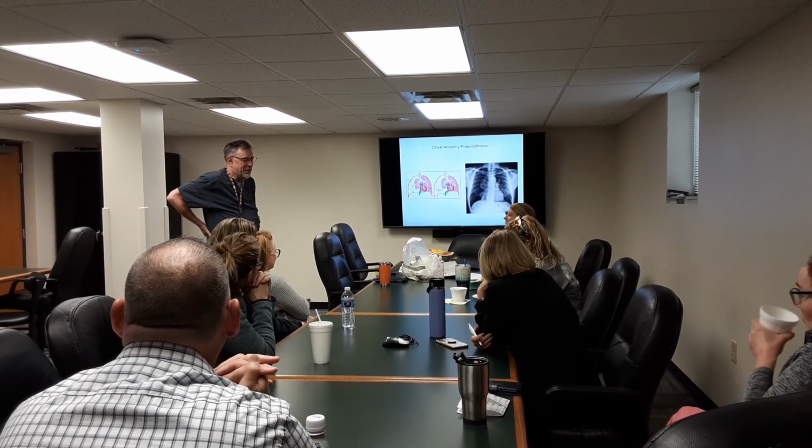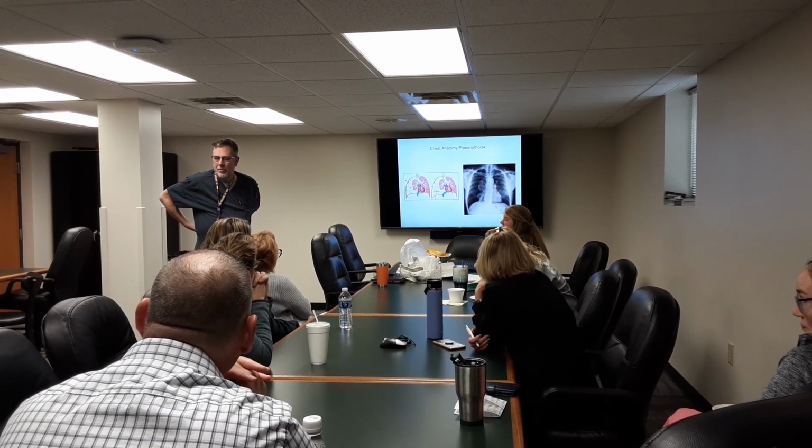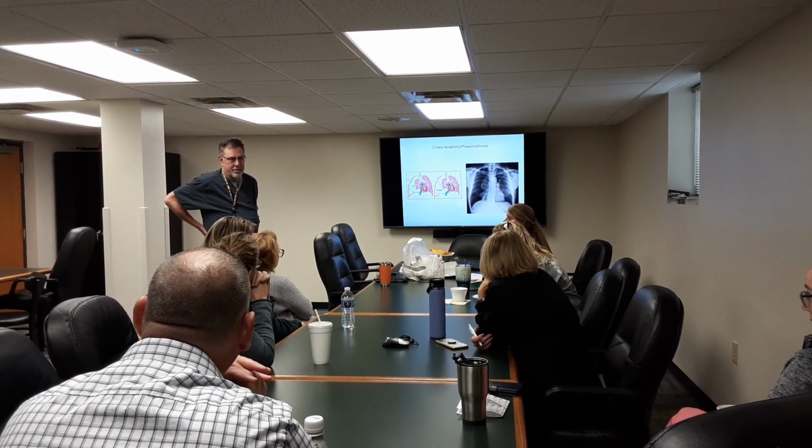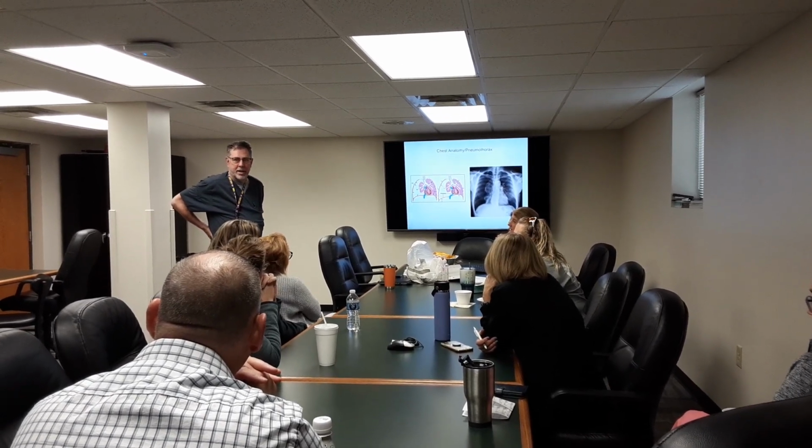So anyway, that's the best place to go. What kind of needle would you use? IV catheter, the largest you can get. And typically we'll just leave the needle in it, so you don't want it to collapse with the catheter itself.